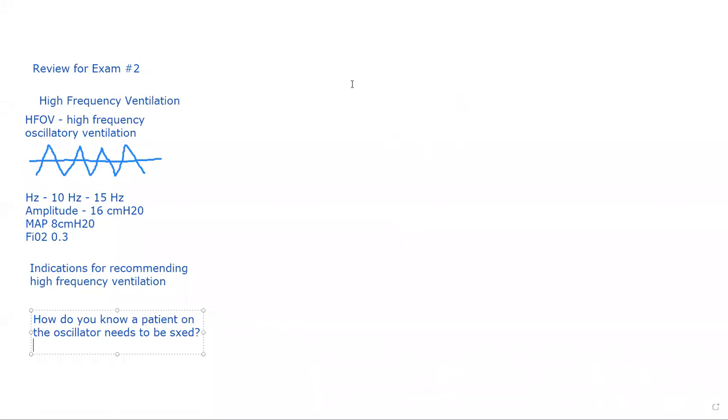All right, now with the jet ventilator. The jet ventilator delivers really fast respiratory rates, not as fast as the oscillator. I think we set up to 600 breaths per minute with the jet ventilator. What else do you have to know? You have to know that you need a special adapter on the endotracheal tube in order to deliver the bursts of air, or the jets of air.